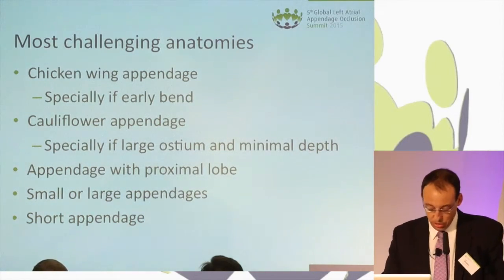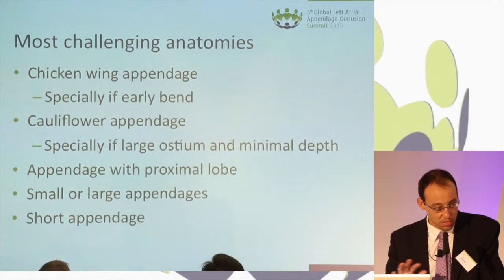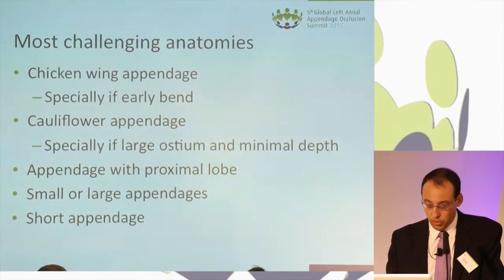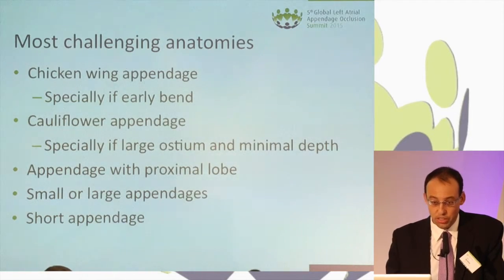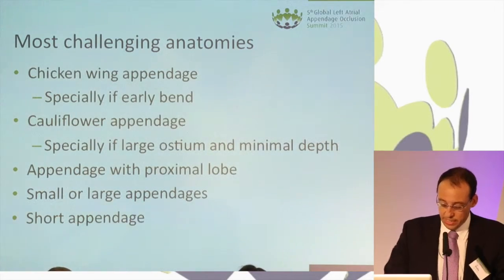And this is something that we covered also during the proctor meeting yesterday, because even if you have tons of experts in a room, we don't necessarily agree on how we close different anatomies, but we typically agree on the fact that some anatomies are clearly more challenging to close than others. So I'm just mentioning a few anatomies that are more challenging to close.